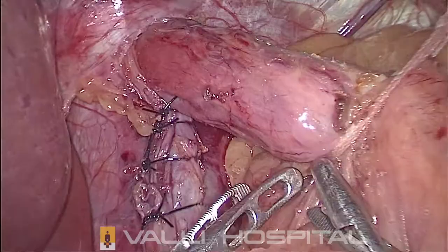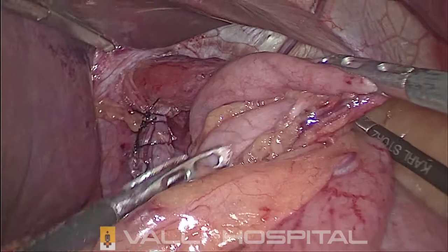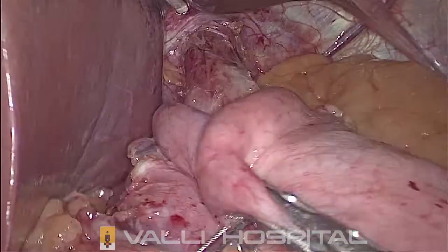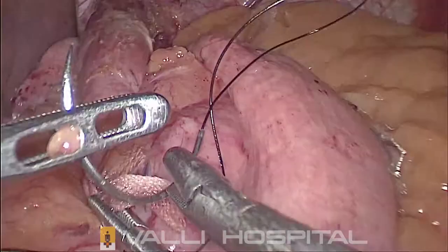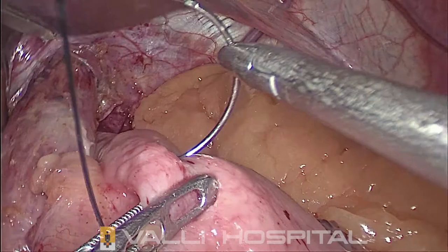Now, the next step is the wrap. Take the fundus. Since the gap is more, the suture maneuver is easier. The same thread is used for the wrap also. With a single thread, we can finish the whole surgery. Take a good chunk.